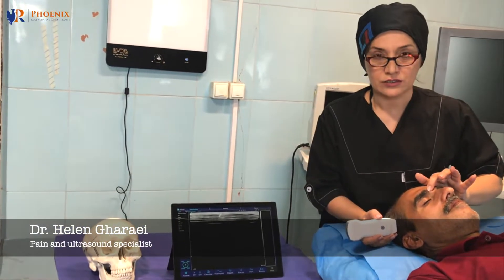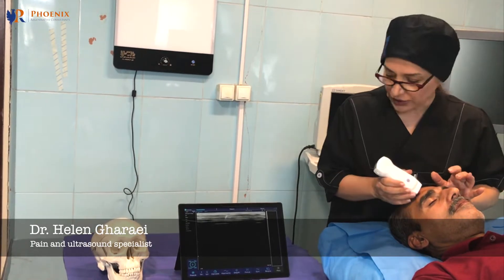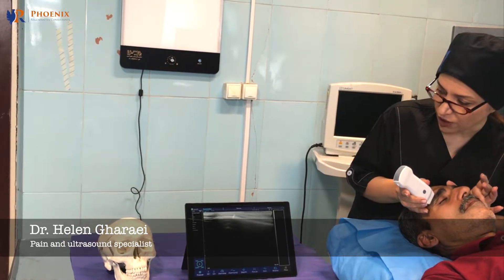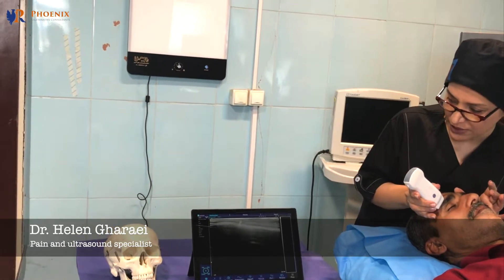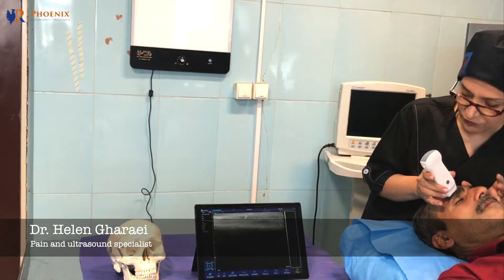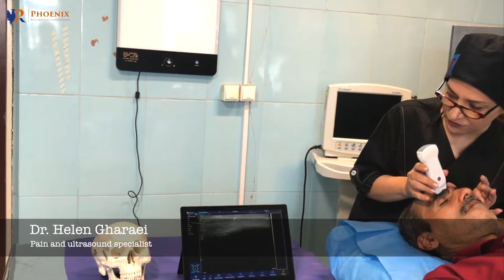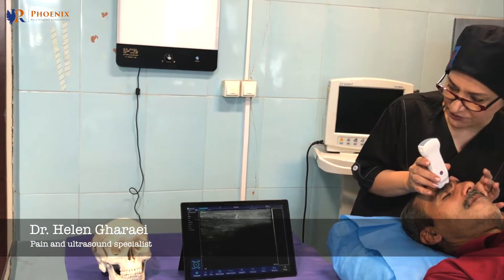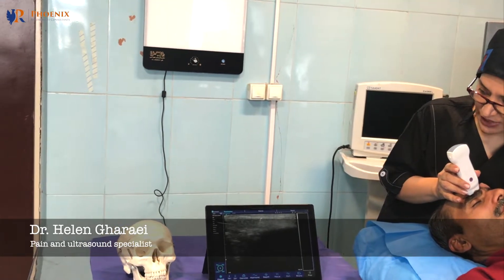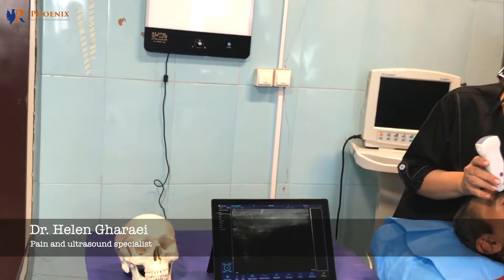Here you can touch the notch of the supraorbital foramen. Put your probe and get a good view of the supraorbital rim, and move it more inward until you see the wedge shape of the foramen. You see the wedge shape of the supraorbital foramen, and you can see the pulse of the artery here.